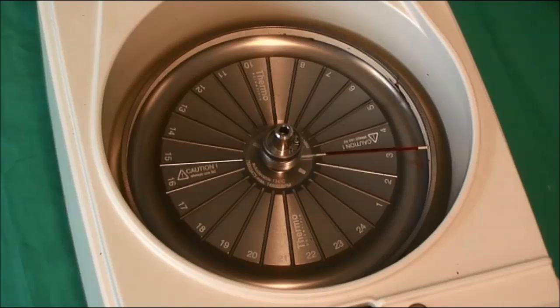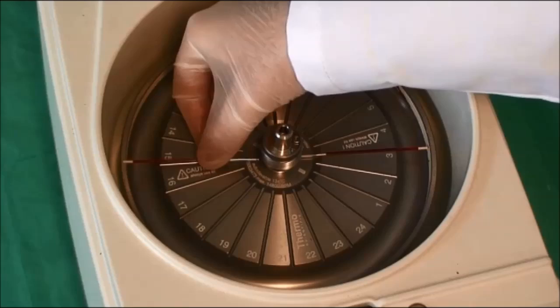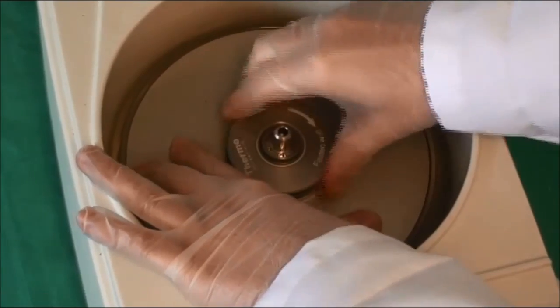In order to balance the centrifuge, place another capillary tube in the groove directly opposite your sample. It is of vital importance that the plate is correctly screwed down to prevent capillary tubes loosening from the grooves and smashing within the machine.